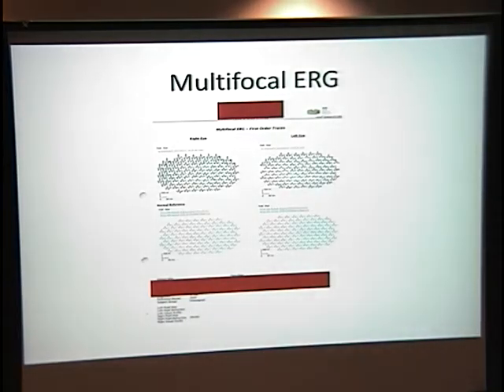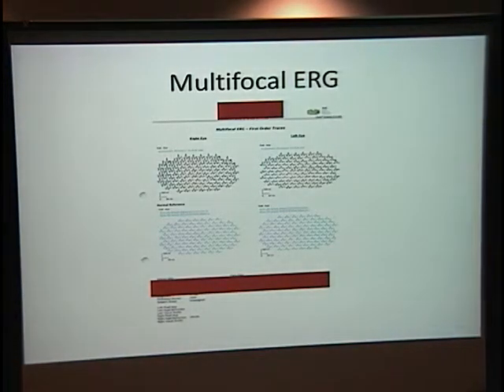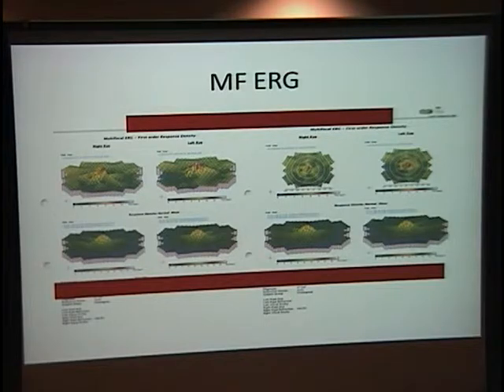Patient had a multifocal ERG performed. So just quickly review, this is the normal reference down here, the blue ones. You expect to see a healthy AB wave. Pretty good in the right eye. In the left eye, if you look close, you have some subtle changes here. But overall, that's a pretty good multifocal ERG, not very impressive loss, but there is a little loss of the wave pattern centrally in the left eye, corresponding with where we're seeing those changes.